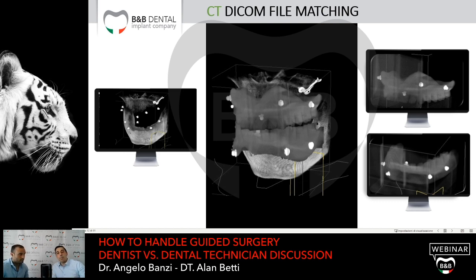Usually the silicone creates a scattering effect, because the liquid part contains some pieces of metal, micro particles of metal, which create a scattering effect. So use just the resin for the prosthesis.